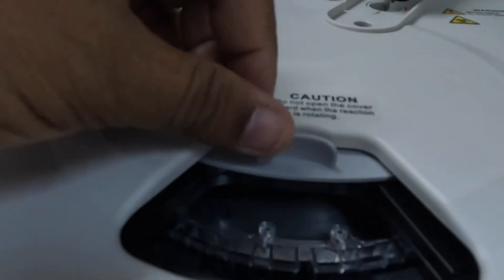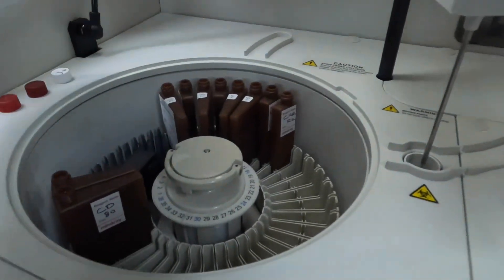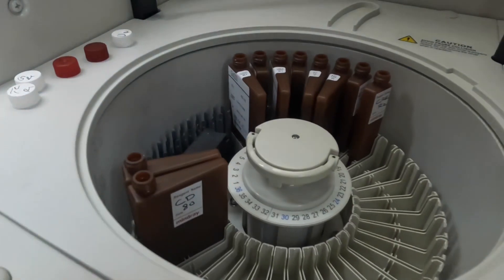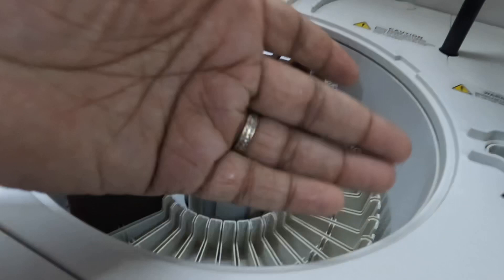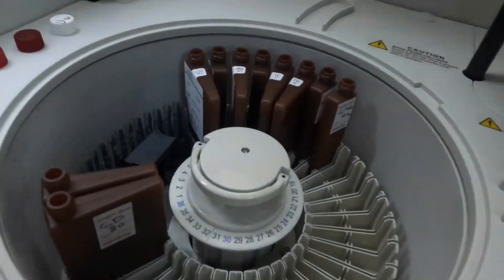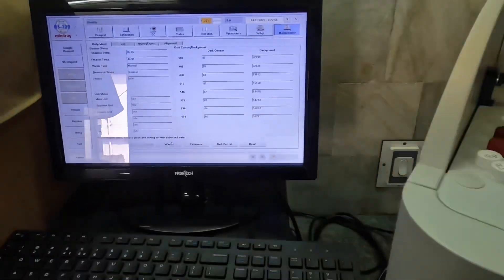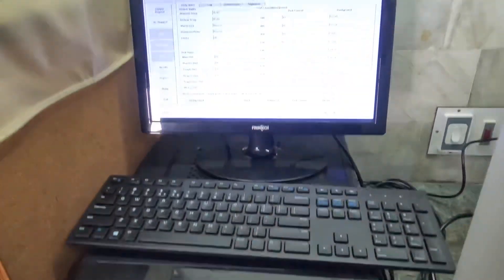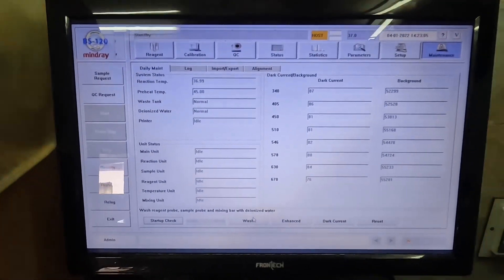This is where the cuvettes are placed — this is where the probe will take the sample and the reagent, mix it in the cuvette. This area is maintained at a temperature of 2 to 6 degrees Celsius, and it is definitely maintained at that temperature inside this disc. We have multiple compartments for both the sample and the reagent inside the disc. This is how it will appear in the computer once the software is installed and the machine starts working. Today we have finished the installation.